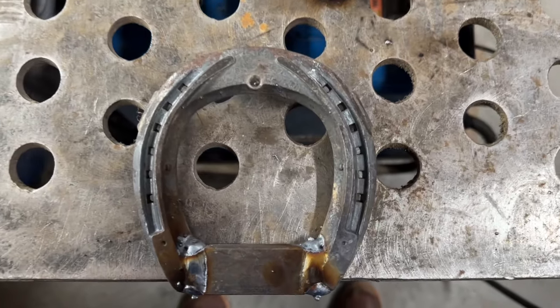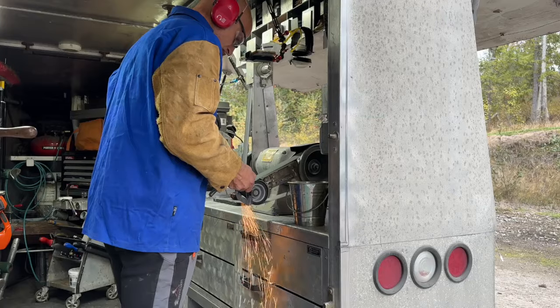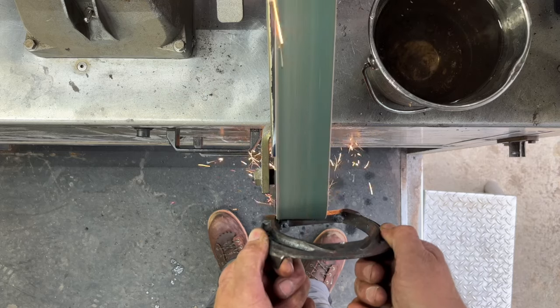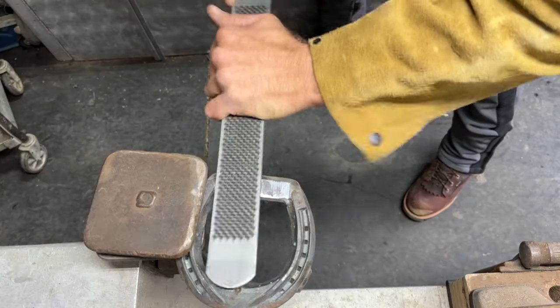Once you have finished welding in the bar, go ahead and clean up your welds with the grinder. Make sure you have a nice square edge between the heels and the bar stock so that your plate can sit flat against it.